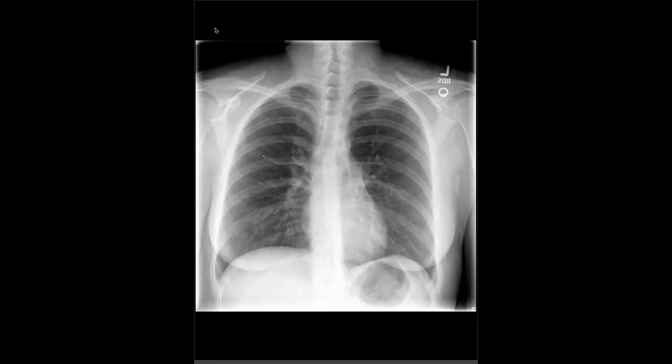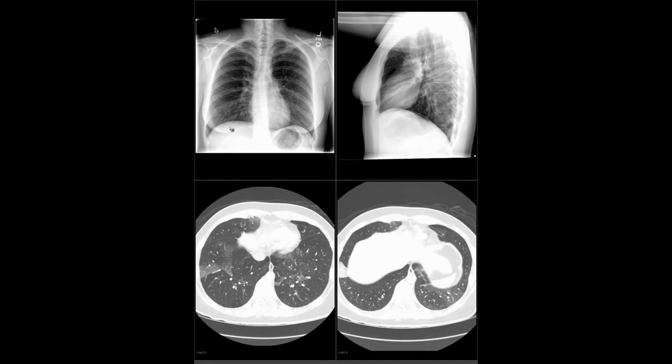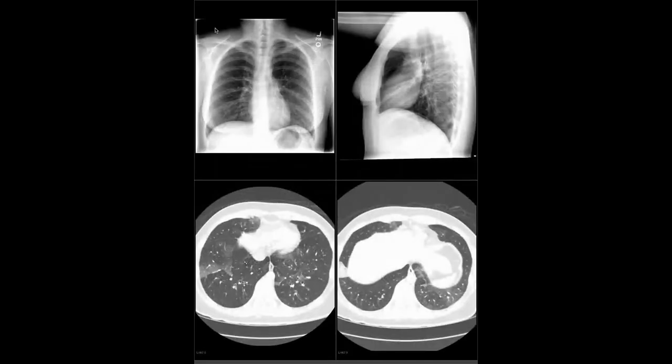Second case, this is a radiograph, young woman, I think cough, no other clinical history. Maybe some airway thickening, not much. Maybe in retrospect something down here, but not much on the AP that caught my eye. I attributed this mostly to breast shadow.